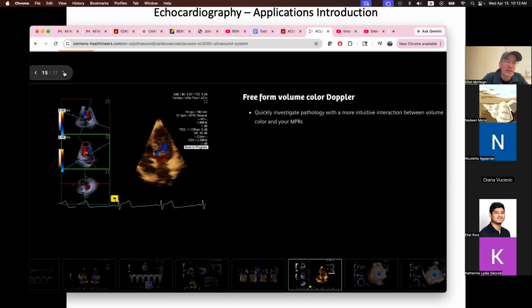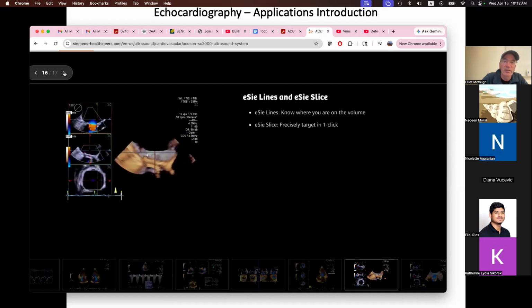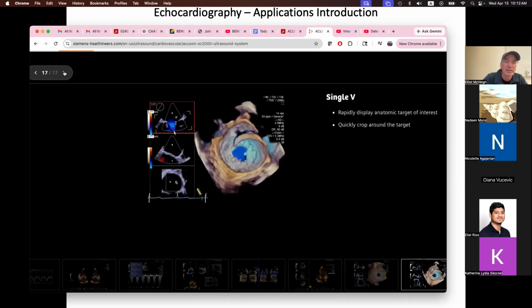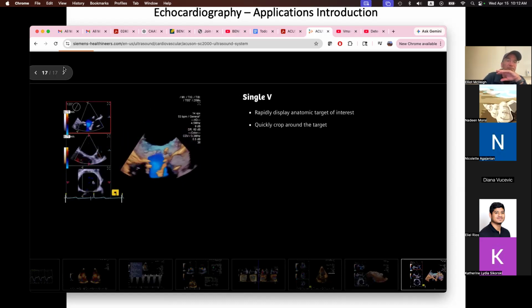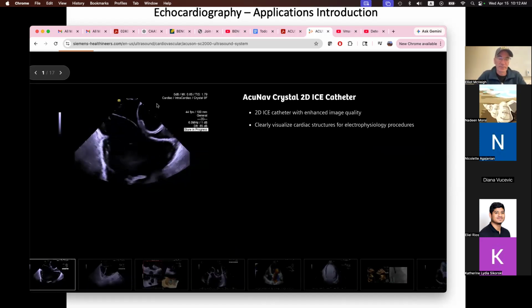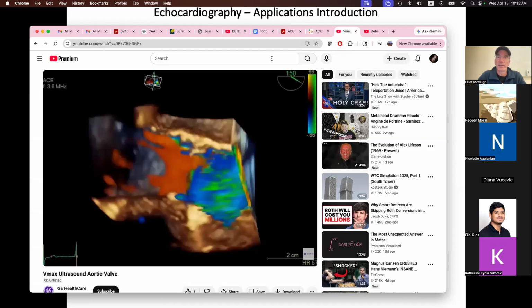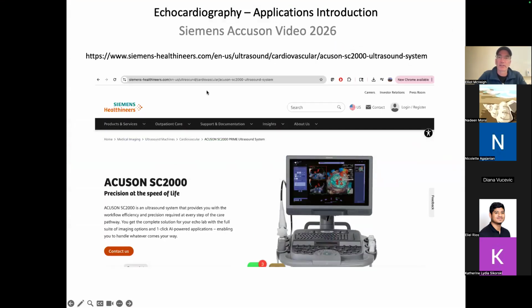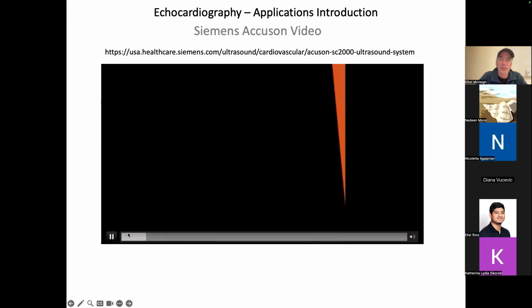Again, that's Doppler in any 3D orientation. Again, the Doppler coming through what looks like a valve that cannot close. And here it is with the device in there. And we already looked at that. Okay. So I'm going to go back out of here. Go back to, I think okay. Again, we already looked at an example like this where we see velocity in 2 directions.